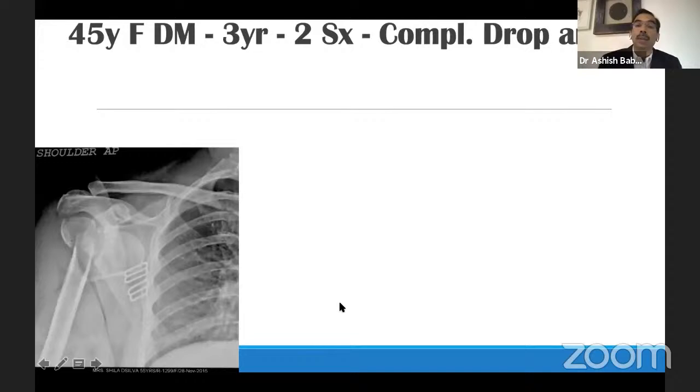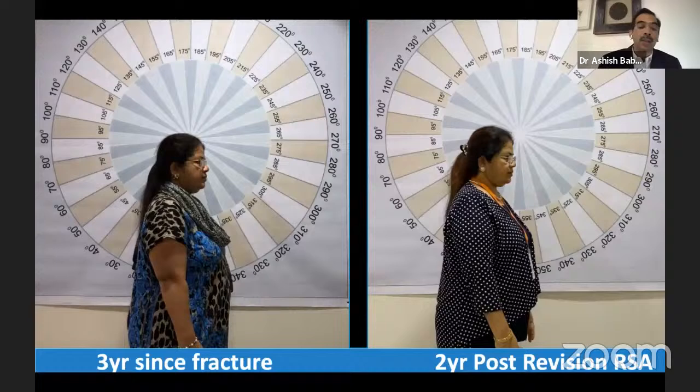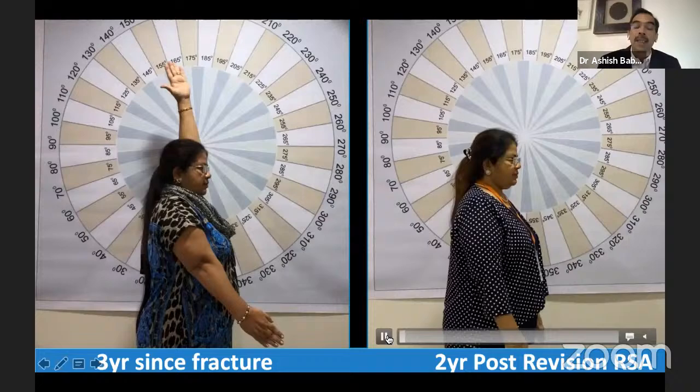So this is a 45-year-old lady, everything gone wrong, two surgeries by a surgeon. We were compelled to do a reverse in a young lady, and you can see that she's done reasonably well, but it's a shame that we had to do a reverse shoulder for a 45-year-old lady.